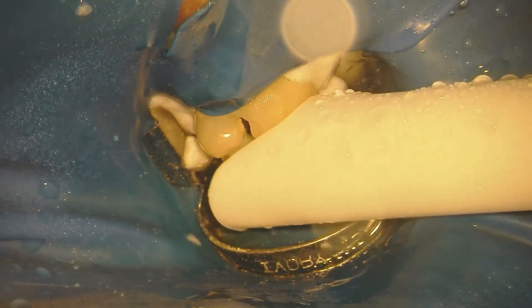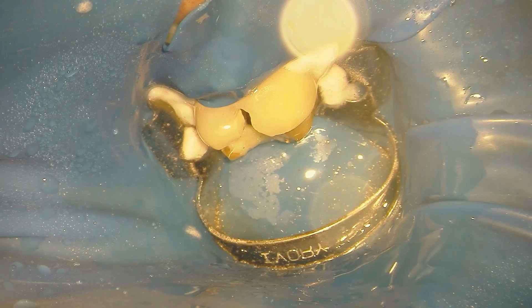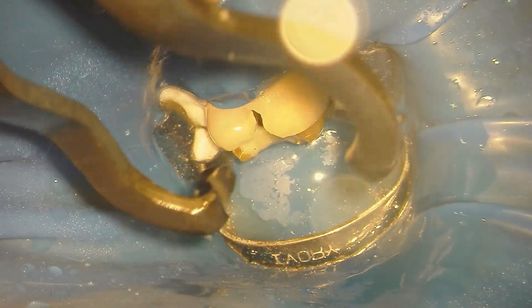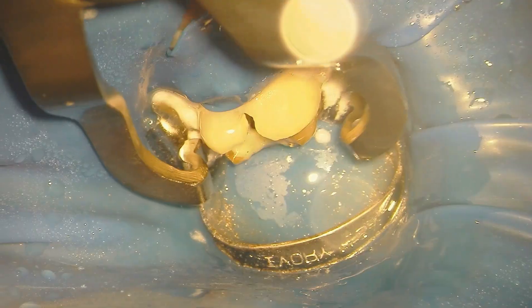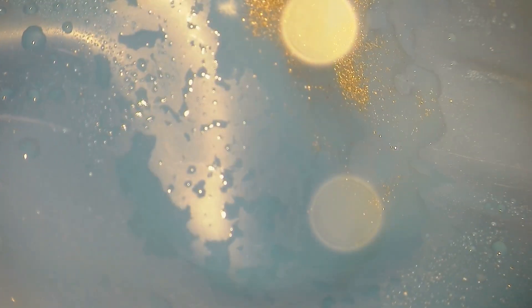We have now torn the dam. We're going to remove that clamp, cut a new hole in a new dam. I like the handy dam. When we cut the holes for that new dam, we're going to do a figure eight.